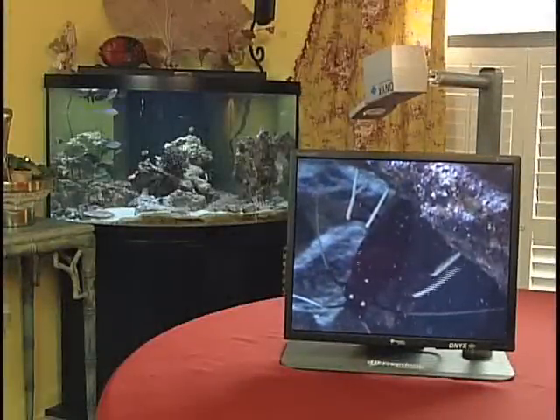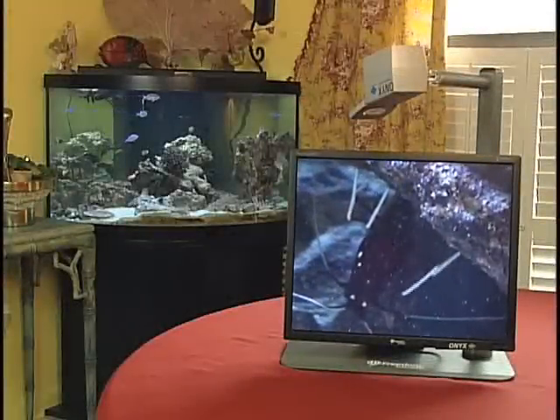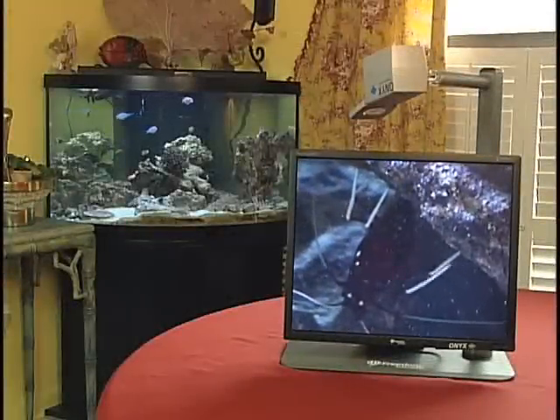I love having a saltwater fish tank. The Onyx lets me sit back and zoom right in on all the action, even freeze the action to get a real good look at even the busiest creatures.